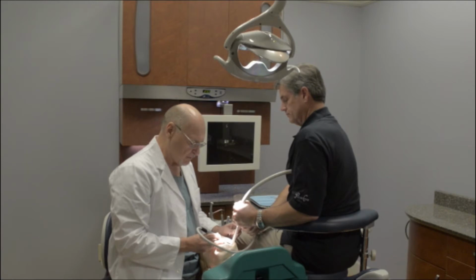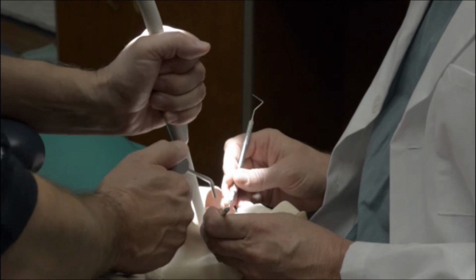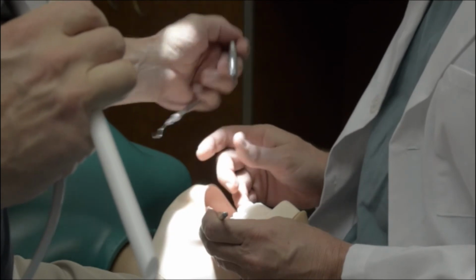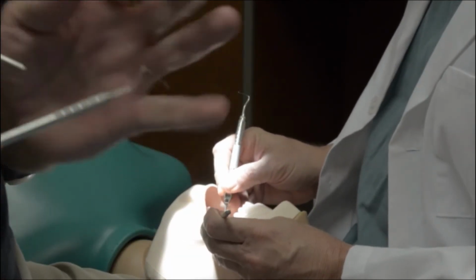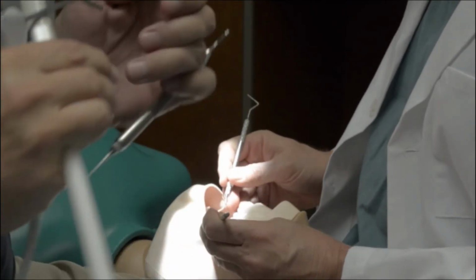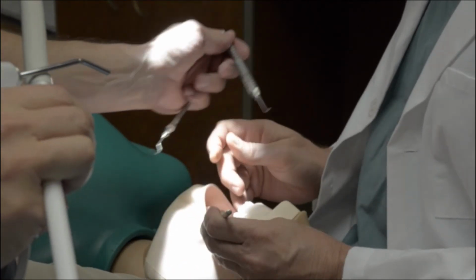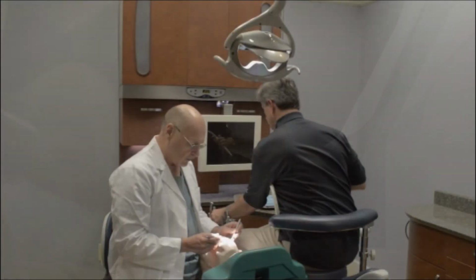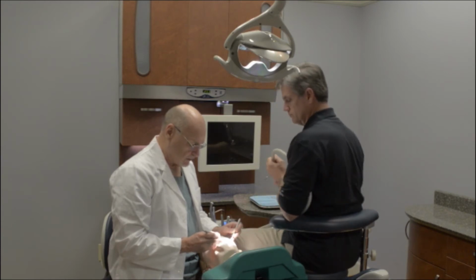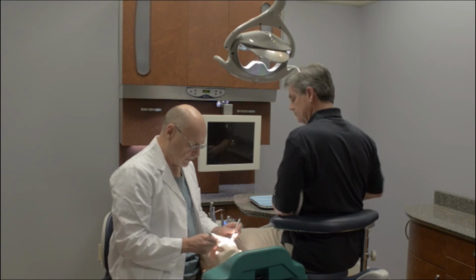And when I'm finished cutting the prep and I now need a hand instrument, the assistant is going to put all of their instrumentation into the right hand, and using their left hand will deliver the new instrument to me, taking the handpiece with the small finger of their left hand, delivering the new instrument to me with the thumb and forefinger of their left hand. And now I've not lost my finger rest, I haven't lost my visual field, and so I'm able to take the instrument and immediately go into the operative field and continue treating the patient.